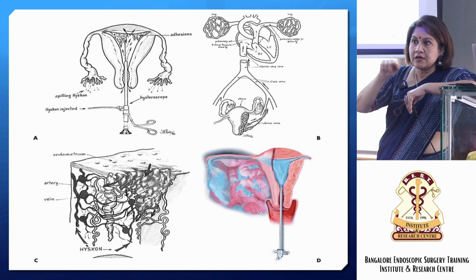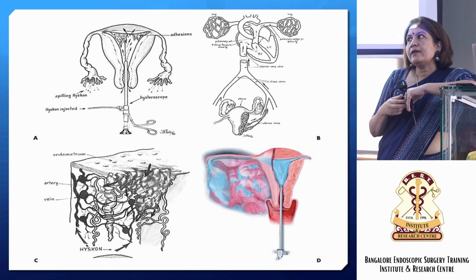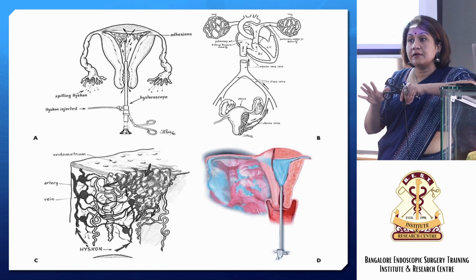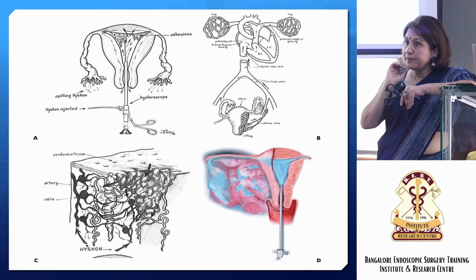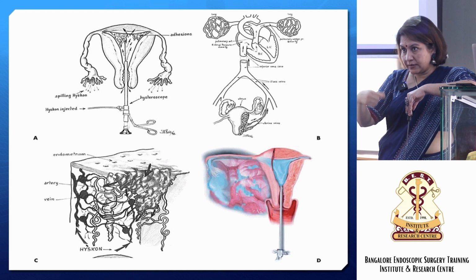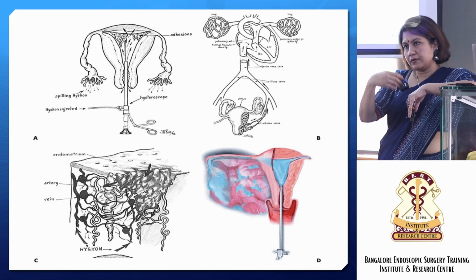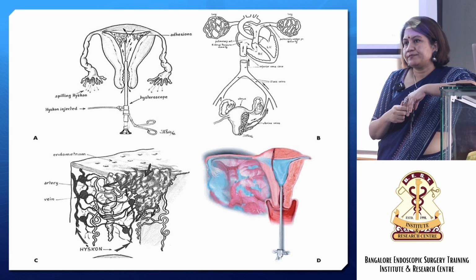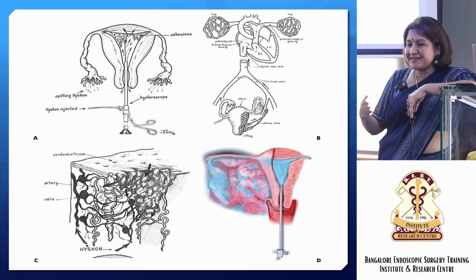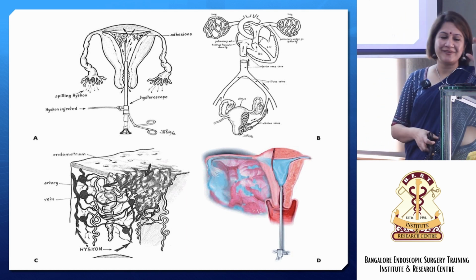But what you're going to lose is from around the cervix; that fluid is lost and you can't calculate it. But if you're having a good system, obviously you don't want it to leak around the cervix, because believe me, you lose the distension. So you need a tight grip when you're doing operative hysteroscopy. About 90% is going to come out through your outlet, so either connect the outlet to the bag or to the suction. What goes to the drapes is negligible. If you lose it in the drapes, it's better than having it inside the patient, so that much error will be taken care of.